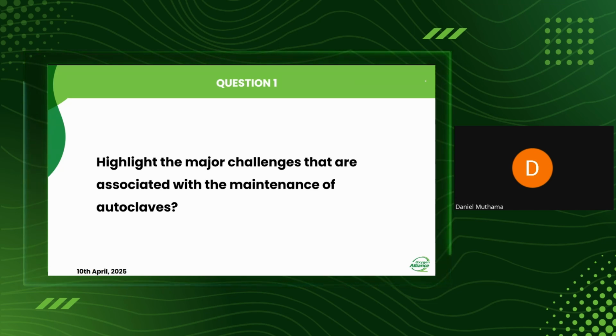I just wanted to add about what the engineer said, the challenges you can get with the electric heating element is the replacement of the immersion type electric heating element. You find that the element is rated 2 kilowatts, and during a replacement some time back I replaced it with 1.5 kilowatts. The heating was low, and that gave me a lot of challenge, only to notice after some time that I had replaced it with a low rated element.